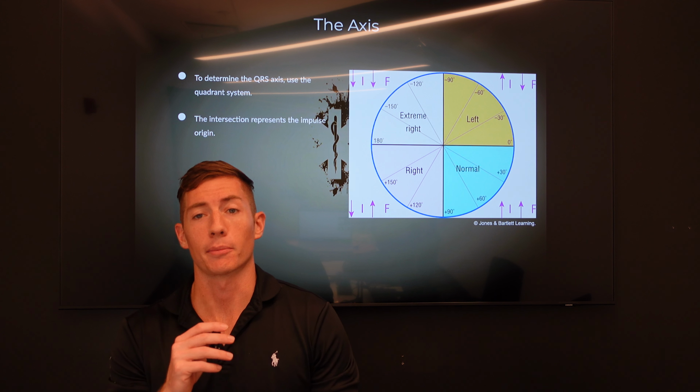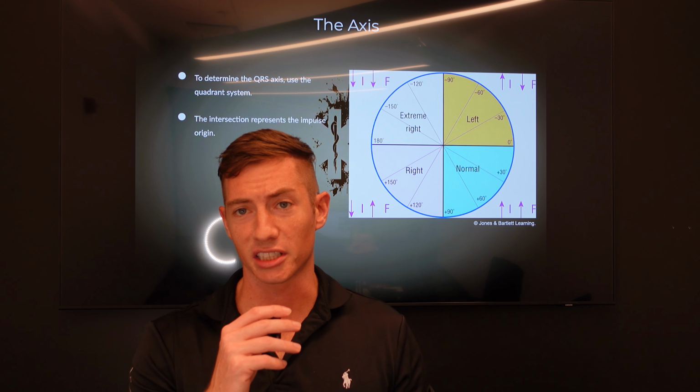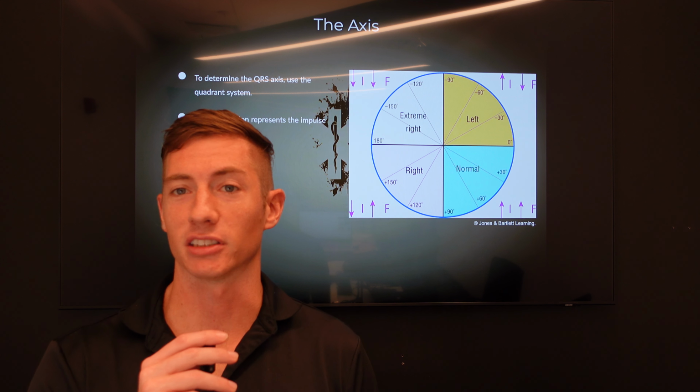AVF lead. I'm sure cardiologists probably have a third dimension that they look at the heart on, a Z-axis, but that is way too complicated for what we are doing behind the dumpster at 7-Eleven.